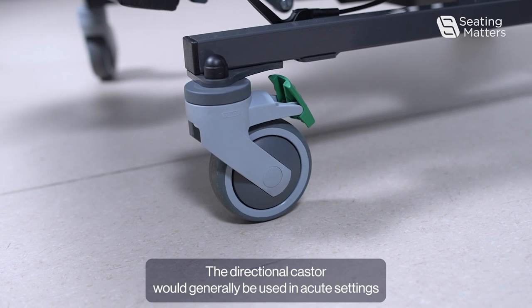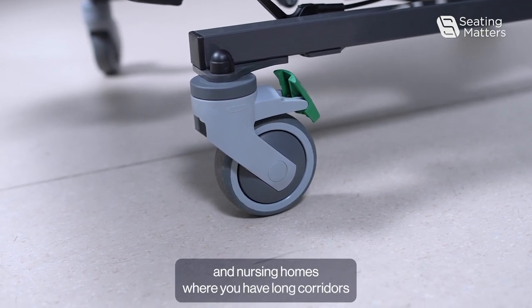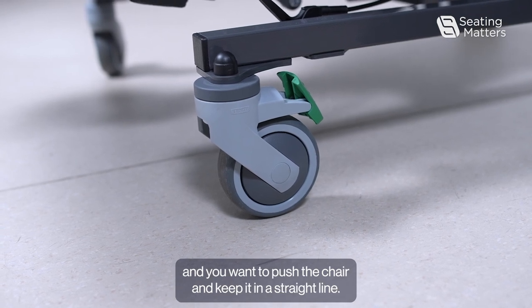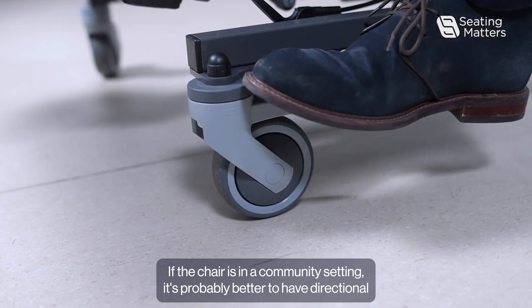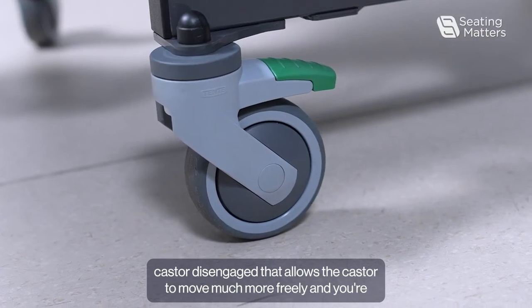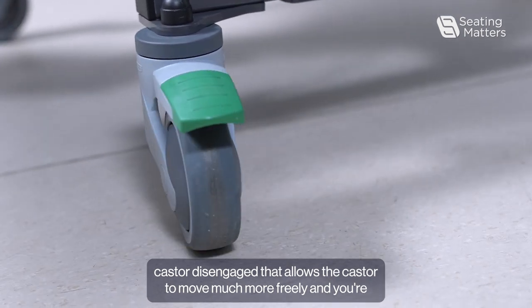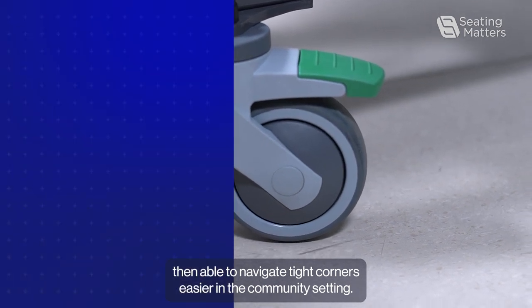The directional caster would generally be used in acute settings and nursing homes where you have long corridors and you want to push the chair and keep it in a straight line. If the chair is in a community setting, it's probably better to have the directional caster disengaged. That allows the caster to move much more freely and you're then able to navigate tight corners easier.